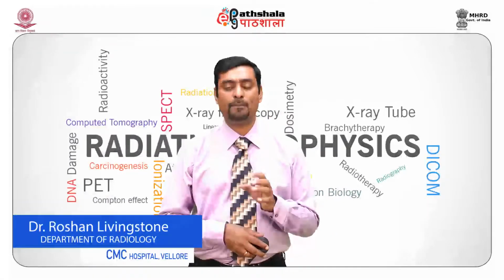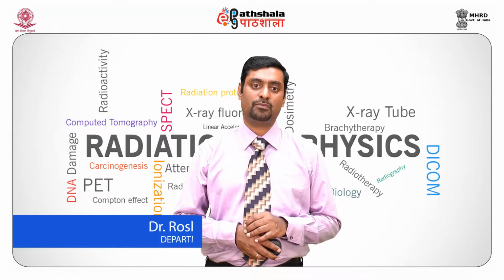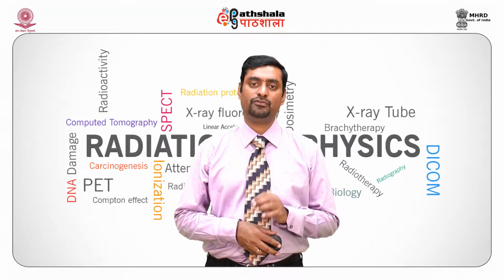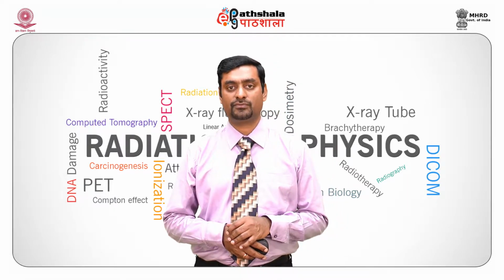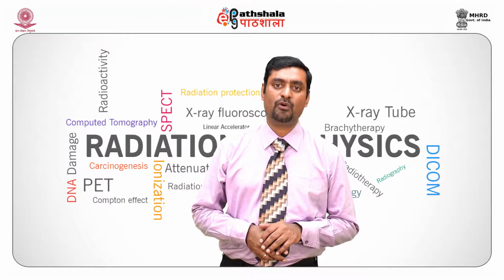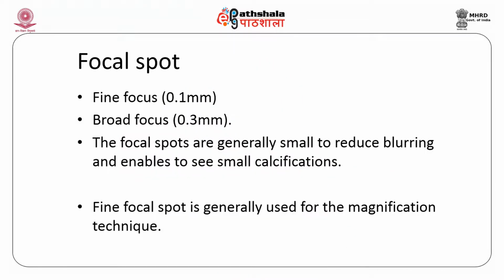Here, to have proper imaging, we need a fine focus or a broad focus. Hence, the focal spot is very crucial for imaging breast tissue. The fine focus is usually 0.1 millimeter. Broad focus is 0.3 millimeter. Focal spots are generally small to reduce blurring and enable us to see small calcifications of the order of about 100 microns. Fine focus spot is generally used for magnification technique.